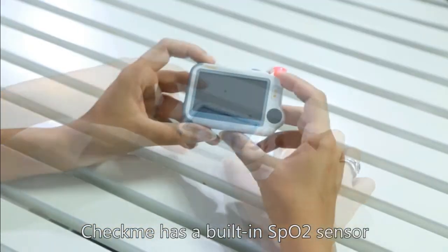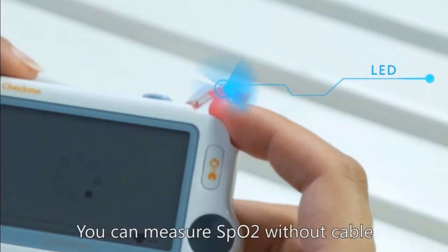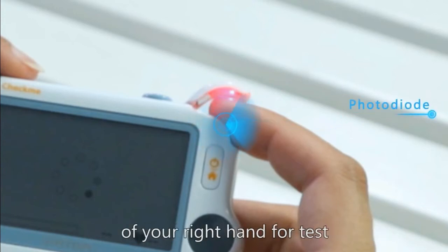CheckMe has a built-in SpO2 sensor. You can measure SpO2 without a cable. Usually, you can choose the index or middle finger of your right hand for the test.